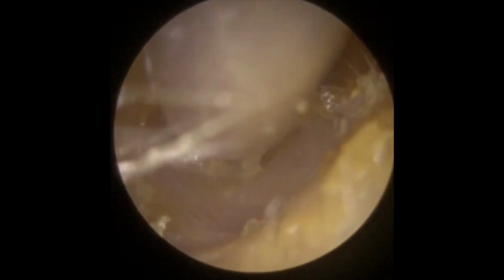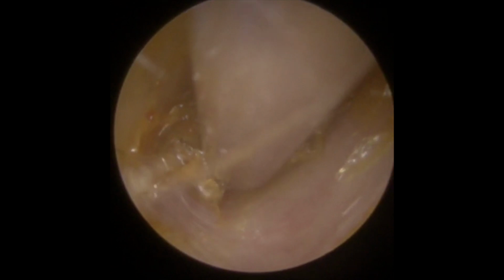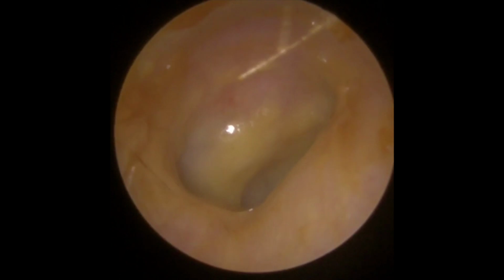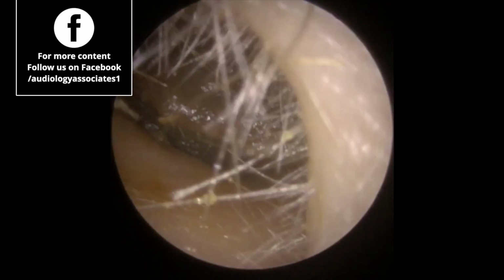So you can see that we've got a really deep piece of dry wax here sitting just in front of the eardrum. So we're just going to lift this bottom section here. There we go. You can see that's coming away nicely. So we check behind, a little bit of oil on the actual drum there.